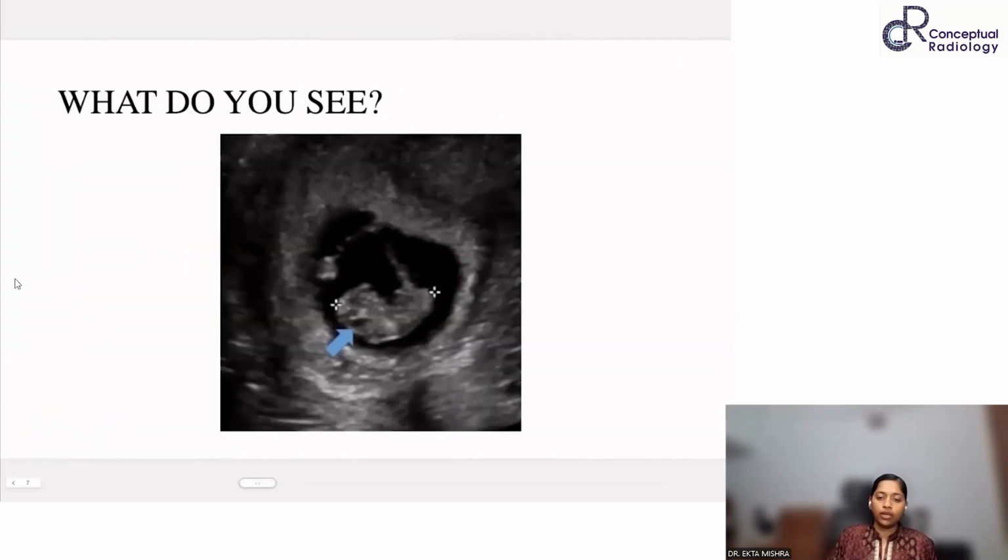Okay. Now we have another structure which we have already discussed. This is the rhombencephalon. This is a structure connecting the fetal pole to the developing placenta, the umbilical cord, and see this is the wrinkled, atrophying yolk sac, the vitelline duct.